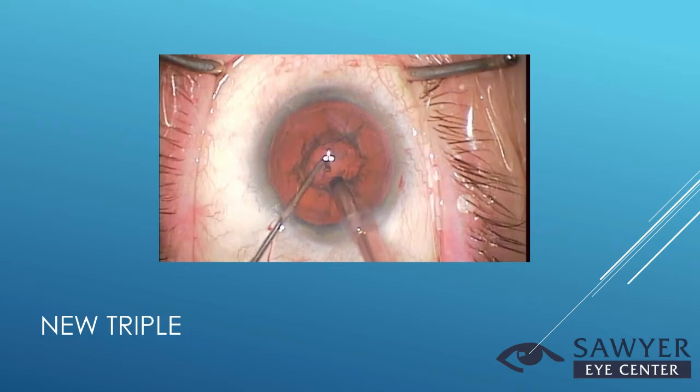To start, you do your regular cataract surgery, much like you always would. Phaco, IA, and intraocular lens placement. After this, I'm creating a peripheral iridotomy inferiorly to help with the gas bubble management after the surgery.